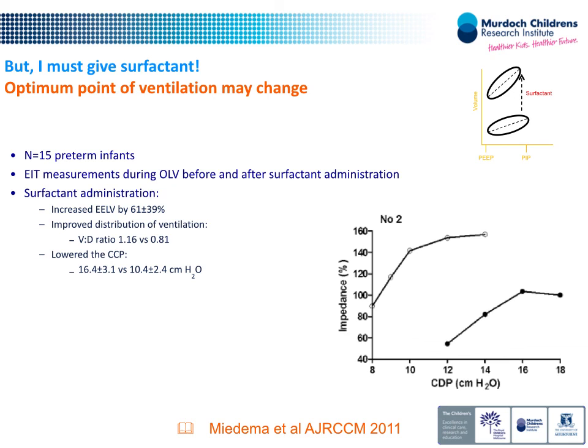If the baby's the same, you would expect the baby to have got better in terms of lung mechanics, so why not try weaning the mean if the baby's good, correct? And that's what you were saying earlier. If the baby's got worse in terms of its state, it may be that you're now over-distending its lung as well. If in doubt, you don't re-recruit, you would go down in this case. But the key point here is that you've changed the volume, the numbers you have generated will change as the baby changes, and you need to adapt to that, and it may be that you need to redo your manoeuvre one way or another.